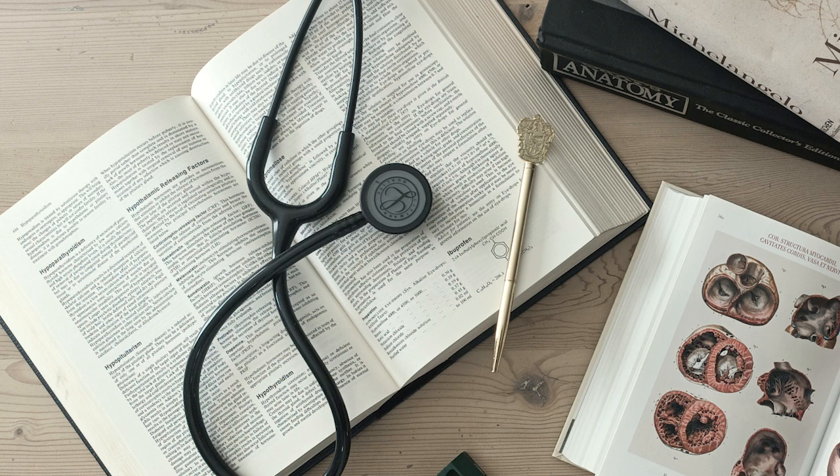Sometimes a P wave falls before, during, or after a QRS, with no fixed PR interval. And sometimes those P waves can be hard to spot in third-degree heart block, can't they? You really have to hunt for them. They can be incredibly challenging, especially if the ventricular rate isn't super slow.